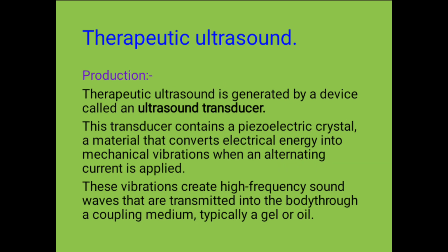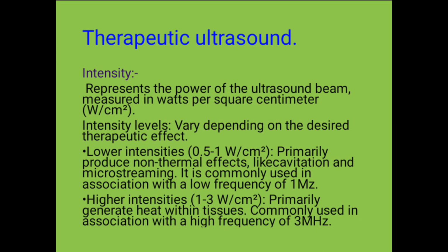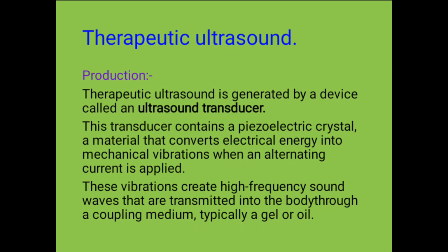So let us check on the production of ultrasound. And when you talk of the production of ultrasound, then you need to be aware that ultrasound is produced by a machine which is called the ultrasound transducer. I hope you've seen the pictures which I projected first. Yeah, so it is produced by an ultrasound transducer, and this transducer contains a piezoelectric crystal.